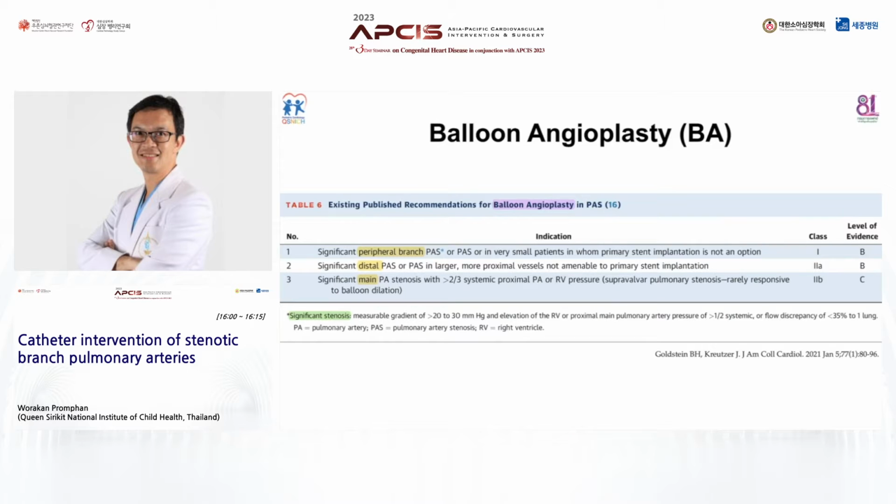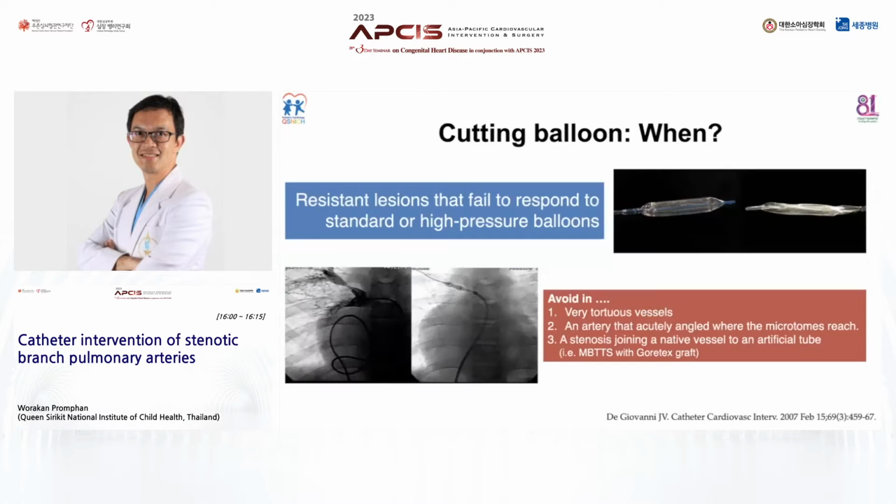The indications for balloon angioplasty, of course, are significant peripheral branch stenosis, significant distal PA branch stenosis, or main PA stenosis, but you may try to use this modality first in small children or small babies. These are the things you may need to consider.